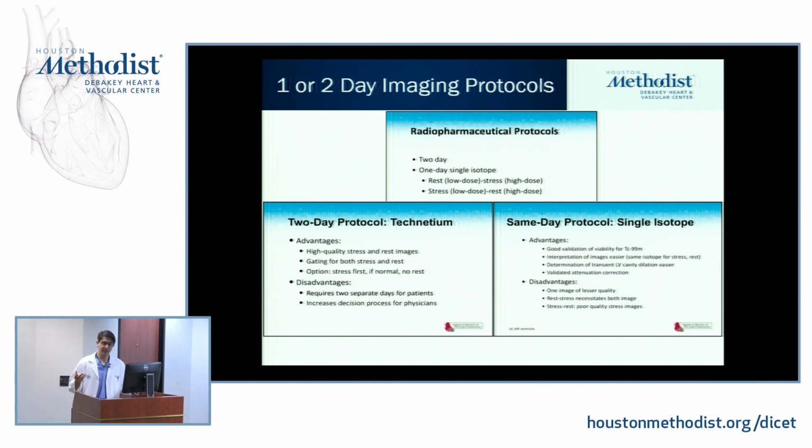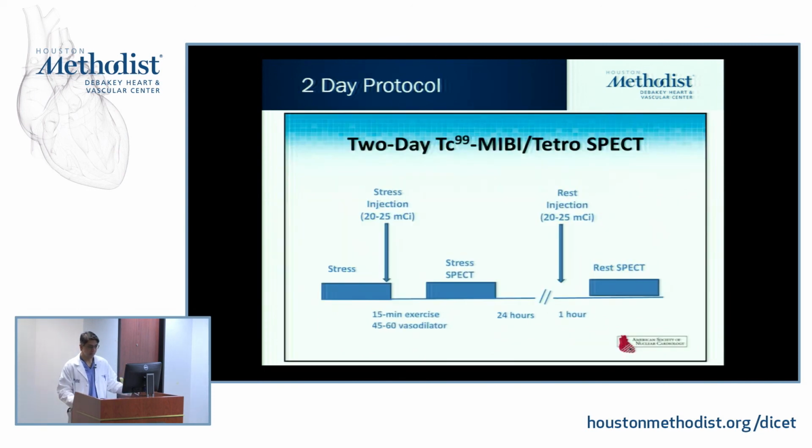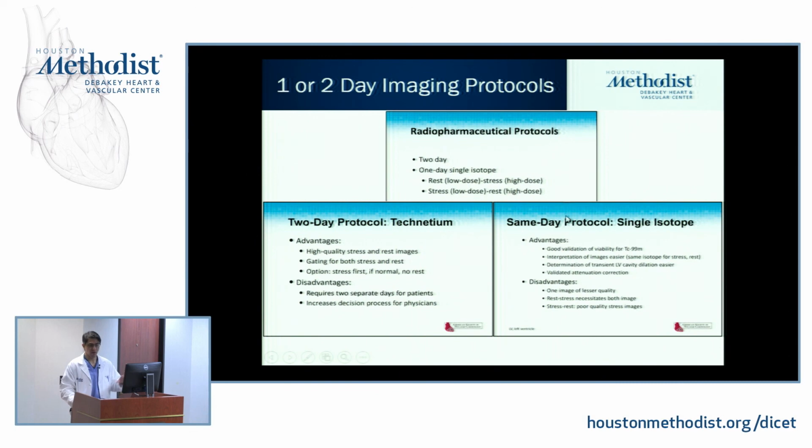Single-day protocols, advantages are, of course, you're done in 1 day. There are some challenges. You have to be able to interpret two different images with different count densities. The stress and rest will have different count statistics, so that's kind of a disadvantage. One image will be of lesser quality. If you're going rest-stress, your rest images will be of poor quality, and if you go stress-rest, your stress images may be of poor quality. And these are all, again, theoretical.